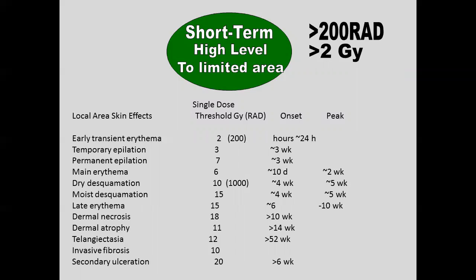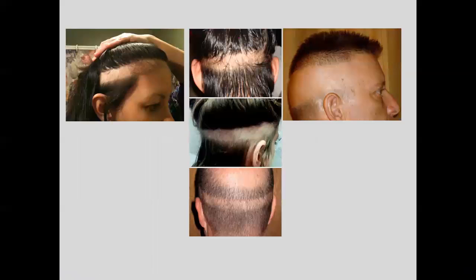Yep. That room, I hate bringing patients into. We do our absolute best to not bring anything that we think could be a complex plasty into that room, because that's the room that's bit us the most. Of the 4 that I've reported in the last year, all came from room 3. So if you go to the VA and need a complex plasty, don't go into room 3. That's the general rule. And like I said, it's going to be very interesting when we get our new rooms to see if those dose rates go down as much as they say. They say we should get a 30% reduction from what we have now because of the new technology. So it's going to be interesting to see.